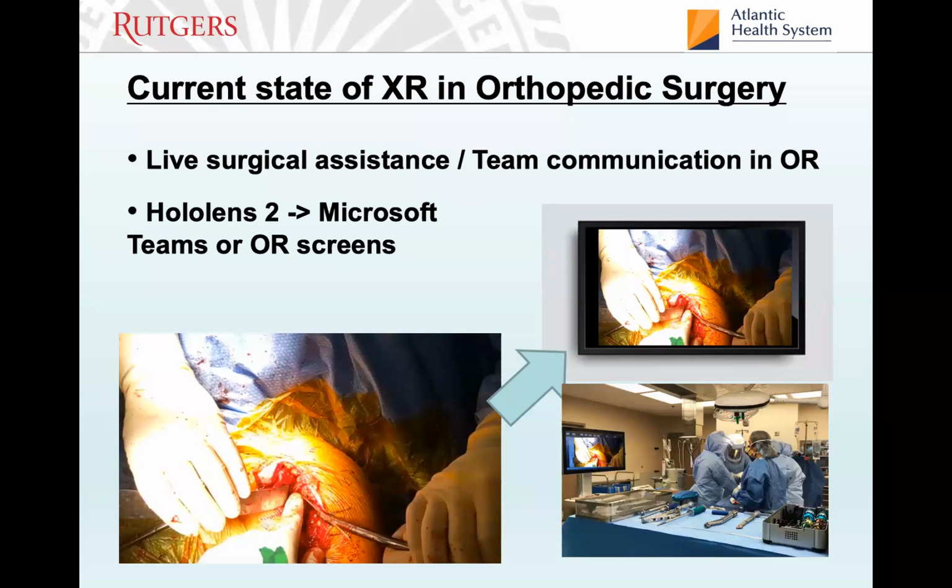But if you think about how you can use this device, it's not exactly the mixed reality component, but these head-mounted devices in general can be used for tons of different things. So if you're recording, that's a picture of something that I was recording during surgery, you can project that to any screen, right? So yes, there's some technical challenges, I'm sure, but you can have that projected to the wall in your operating room so that reps know where you are. In case you have one person holding a hook on another side of the table, they might not know exactly where you are. They can see exactly what you're seeing. So I think from an educational standpoint, it's very good. But it's also nice to make sure that everybody knows exactly where you are, what's the next thing you need? It helps people stay sort of focused. So that's one good thing about it.